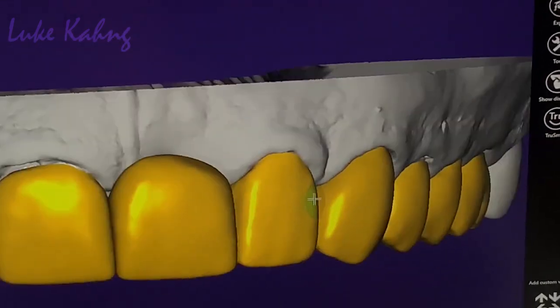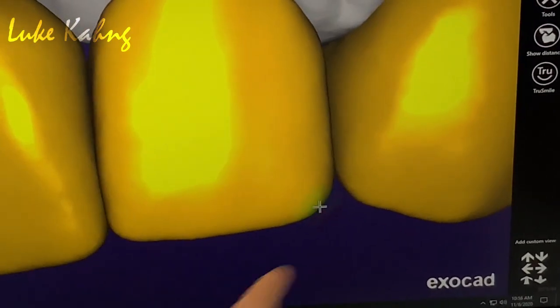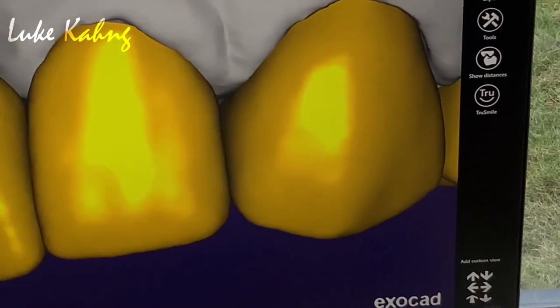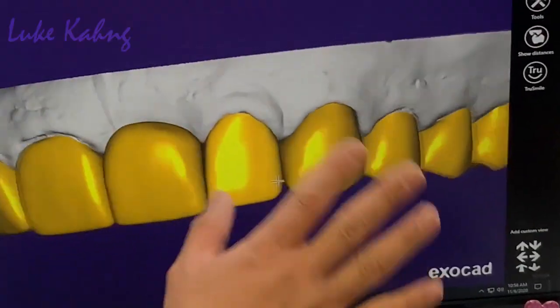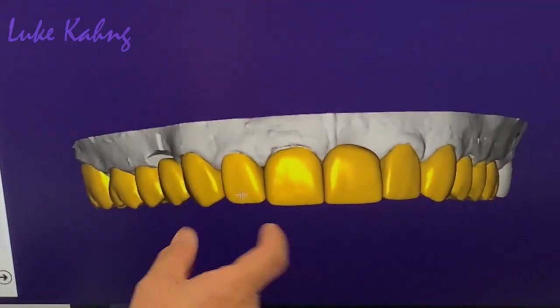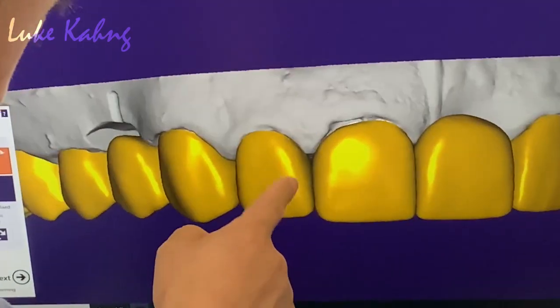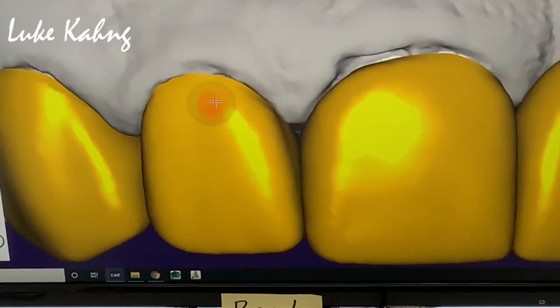Yeah. Still, you can make the scales okay. Make it a little thicker. Okay, this canine, move it. All right, better. Now go back to here. Same thing. Still small, the line angle is over there, and then round it, and then bigger.